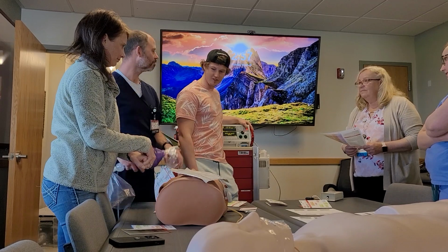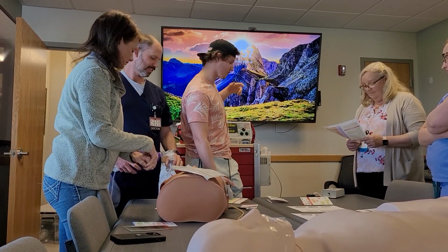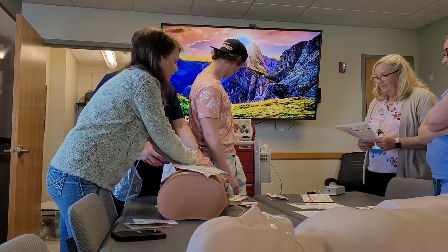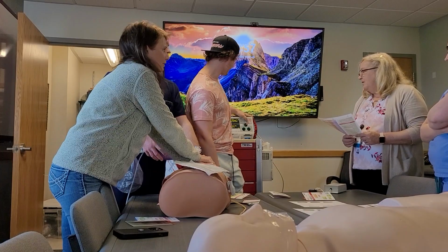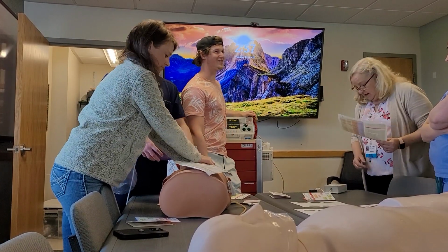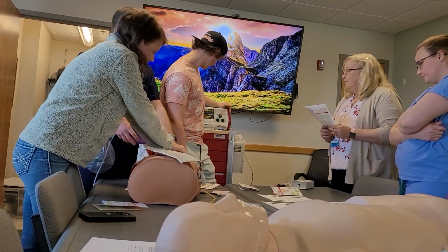Charged. Ready. And shock, sorry. What was that? You can go higher voltage. Oh, I thought 200 was the max. Yeah, you can go to 300. Okay, my bad, but we're good. Next time we'll go higher. We'll go 300. Okay, and after that, we ended up with this.